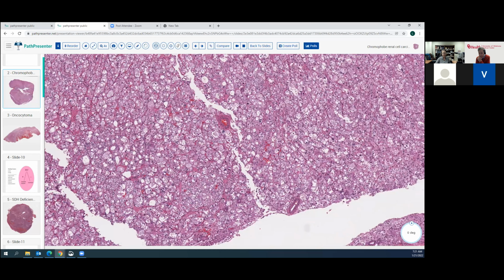Sometimes they can get a little bit bigger and a little more prominent. There's some more here. Just these little pink eosinophilic cytoplasmic inclusions. Some of these are RBCs, so we have to be careful. Yeah, here's a nice one here.